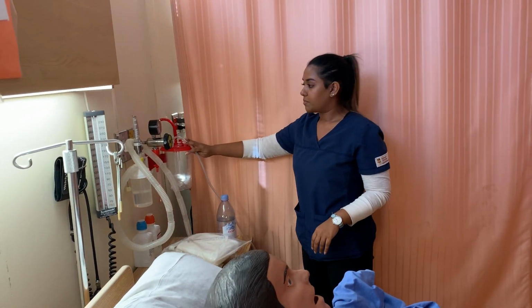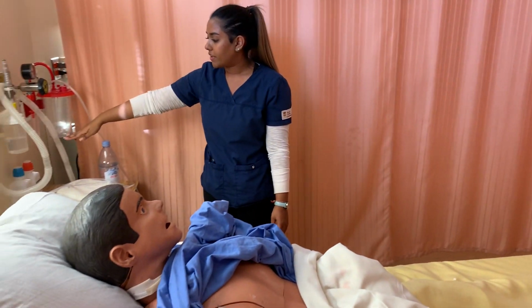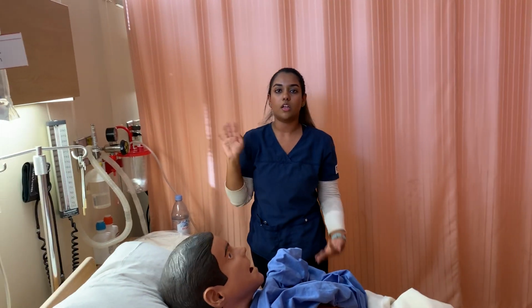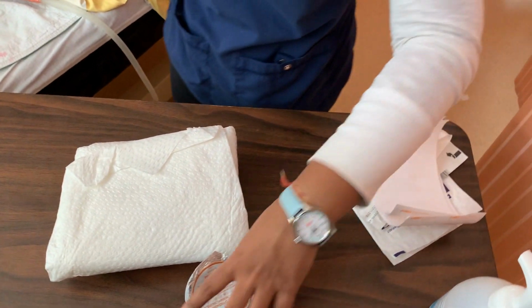I'm going to follow the suction all the way up and make sure everything is plugged in and it's set to suction continuous low in the green, which is correct as per ordered. We have here sterile water, normal saline, and we have the clamps as well, just in case there's an emergency. We have all the emergency supplies and kits. Okay, so now I'm going to redo their dressing.